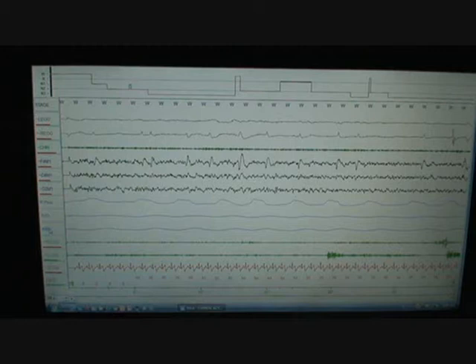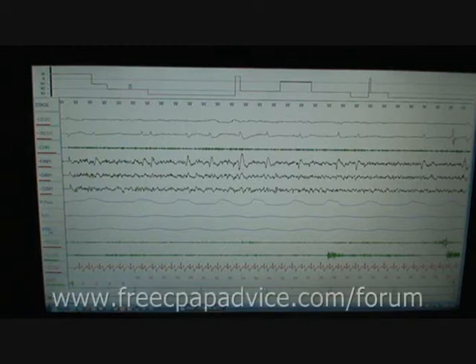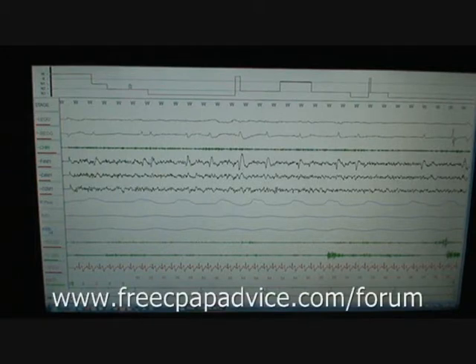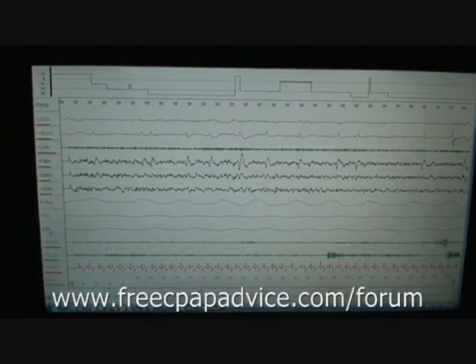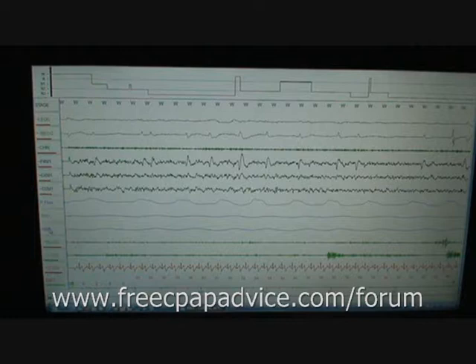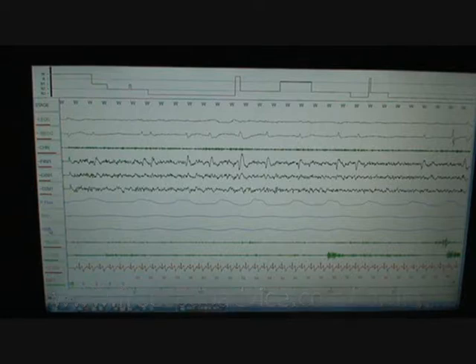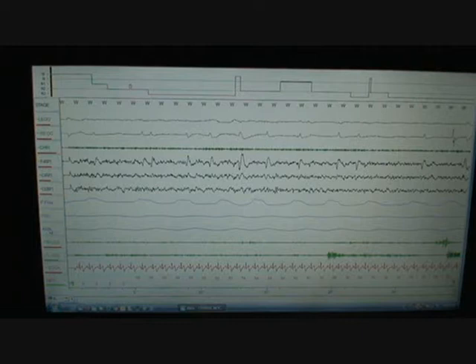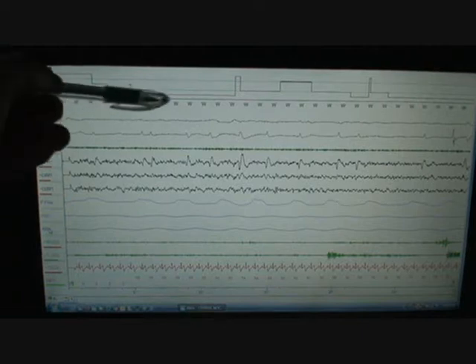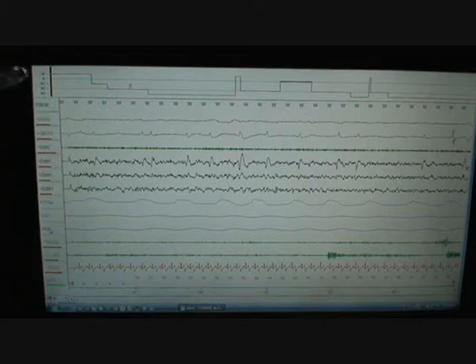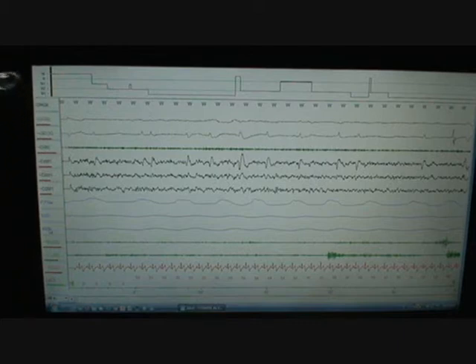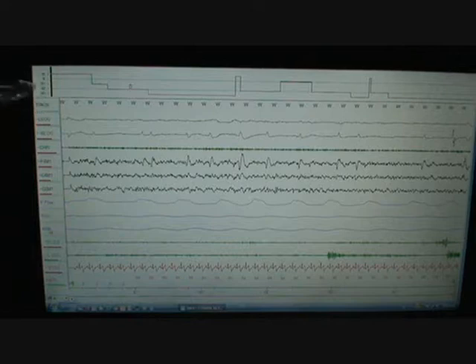Okay, so this is a normal, healthy sleeper, relatively young, in their 20s. And I just want to take care of a couple quick housekeeping things. If you have any questions, please direct them to my website at www.freecpapadvice.com/forum. The other thing is, up here on the top is where the stage is being shown. I've already actually scored this, so what we're just going to be doing is reviewing it.